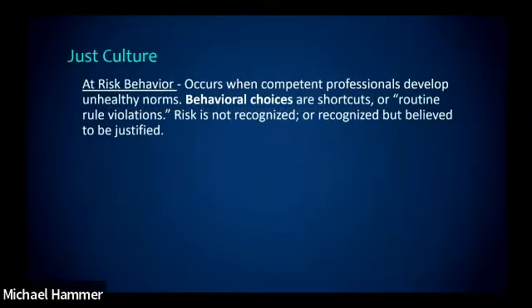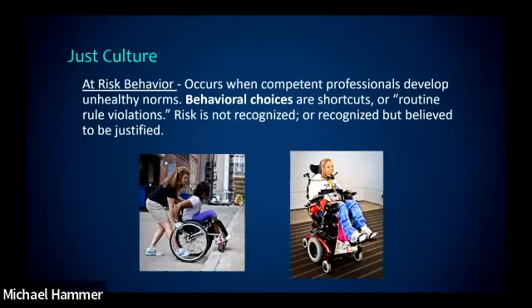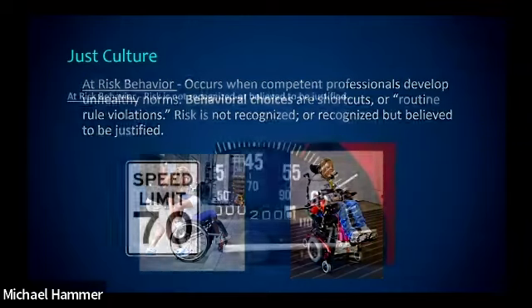When we look at at-risk behavior, that's when I'm cutting corners. I know what the rules are, but I'm cutting corners. So when we look at teaching wheelchair skills training, at the beginning of the session I talked to you guys about people falling, people getting hurt using their wheelchairs. How good of a job are we doing with teaching people appropriate manual wheelchair skills and appropriate power wheelchair driving skills? We know we have evidence-based applications of how to teach wheelchair skills and the comprehensive list of items that need to be taught, and yet too often those are skipped. I would think of that as risky behavior on the part of us as professionals.